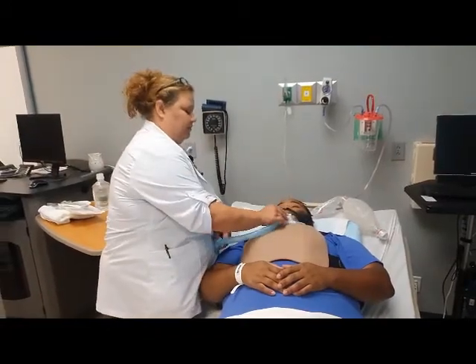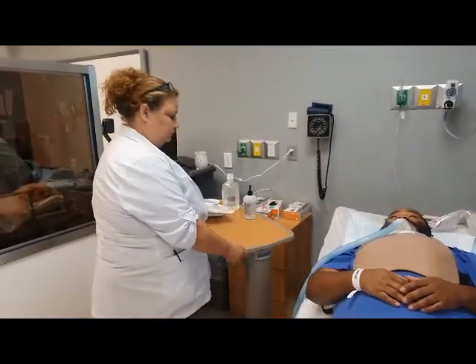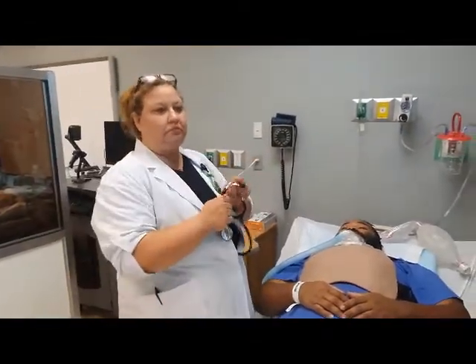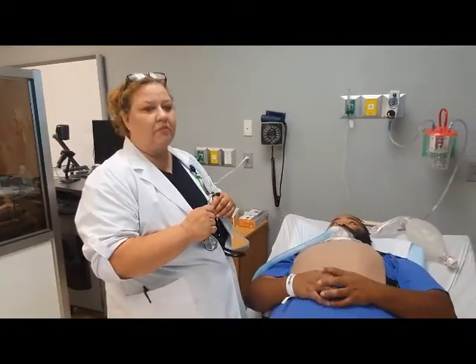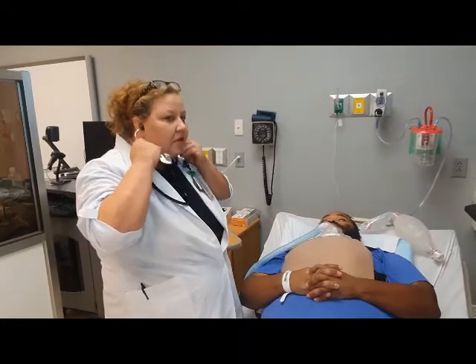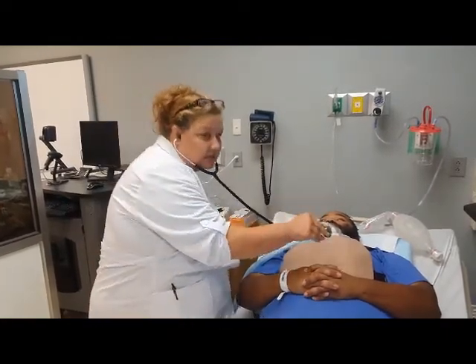All right, at this time, you'll assess the respiratory status: shortness of breath, coughing, respiratory rate, skin color, breath sounds, heart rate, rhythm, or O2 sat. Remain mindful of the heart rate and O2 saturation during the procedure. So at this time, you can listen to the lungs.